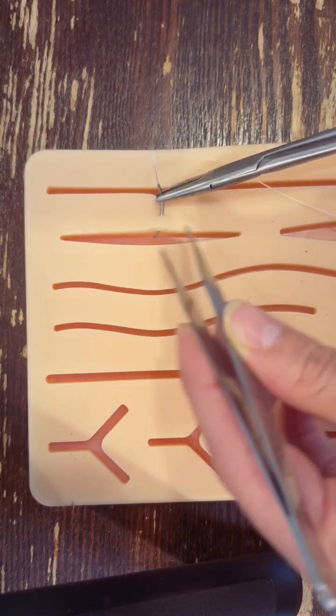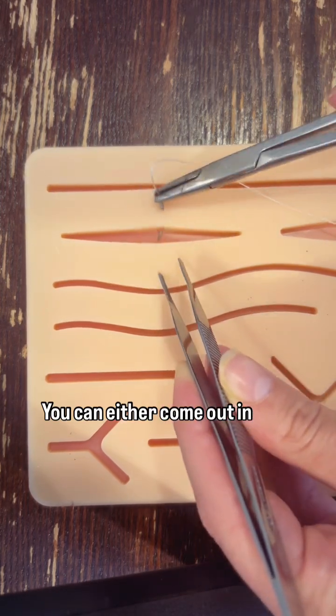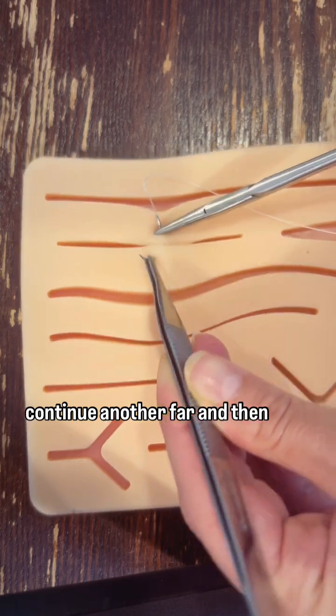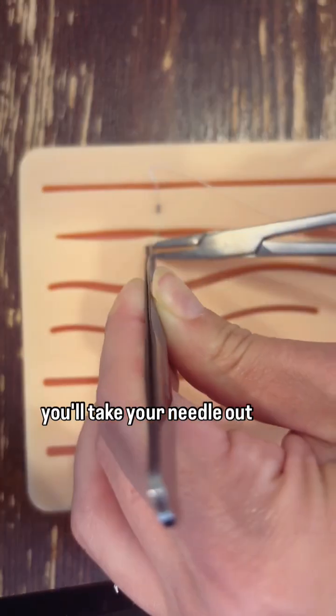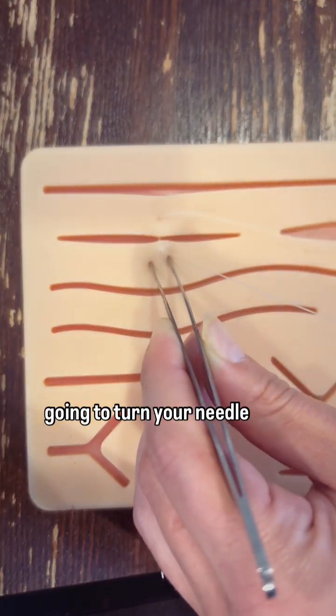Okay, so let's do it. Far - you can either come out in the middle or you can just continue another far. Then you'll take your needle out, and you're going to turn your needle around in your needle driver and backhand it to do your near near.